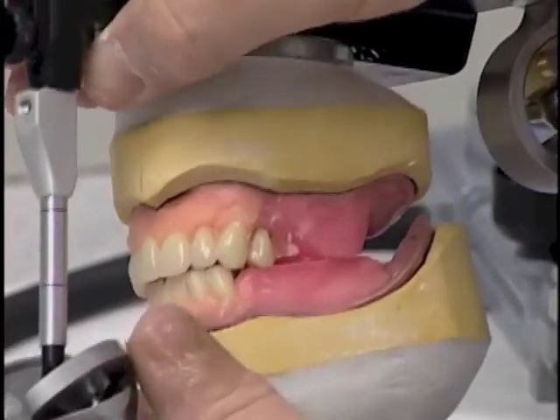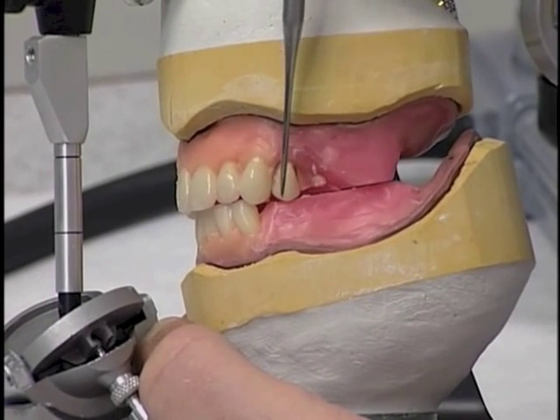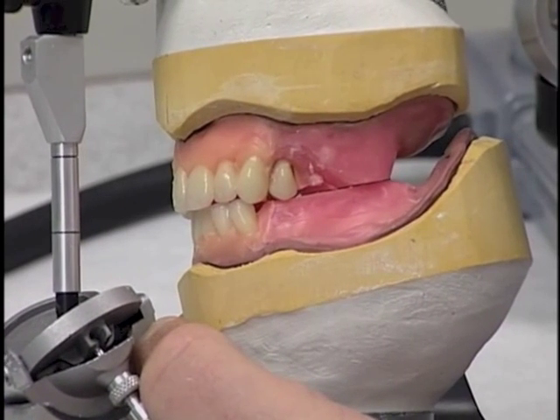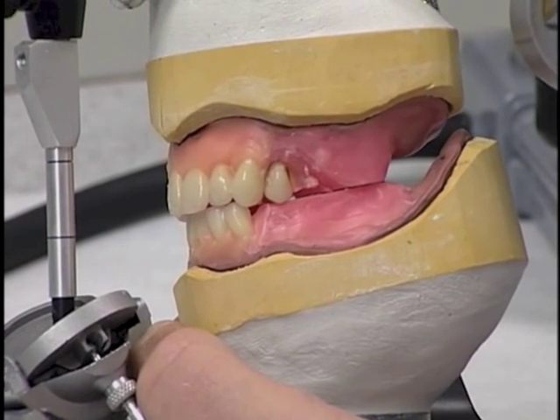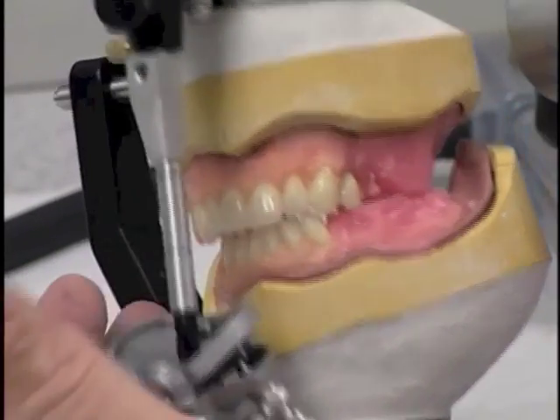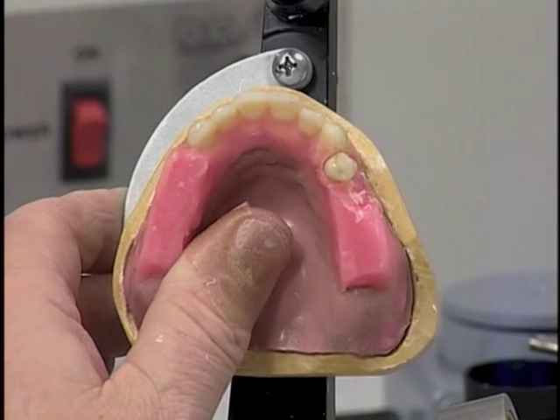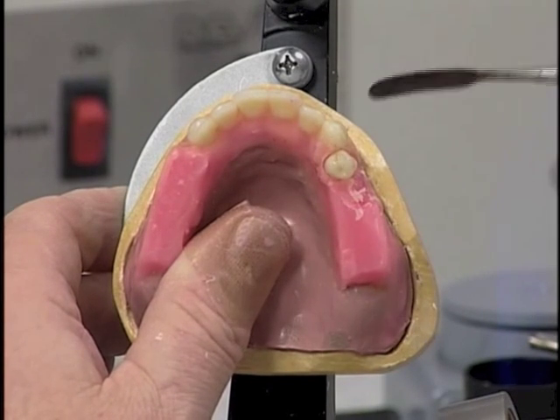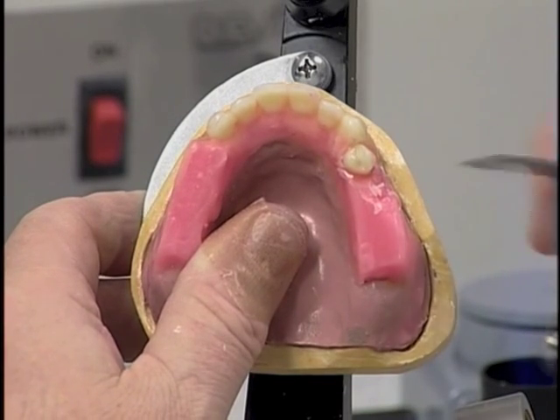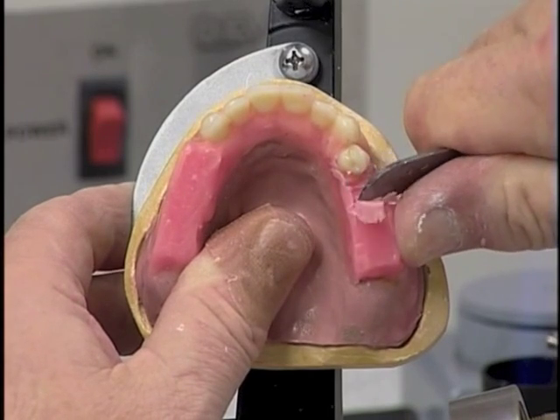The next thing we would like to look at is the long axis of the tooth once again, and looking at the long axis of the tooth, it should be virtually vertical and not tilted this way or this way. And that tooth appears to be virtually in a vertical position, which is where we would like it. So now we're ready to arrange the second premolar. First of all, stabilizing that first premolar that we've arranged by just flowing wax around it. And now let's remove enough wax to accommodate the second premolar that we want to place in there.